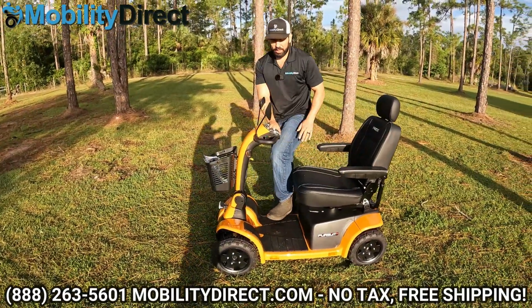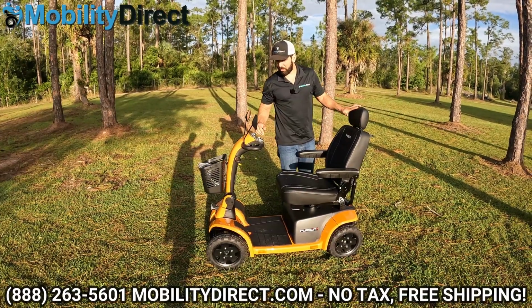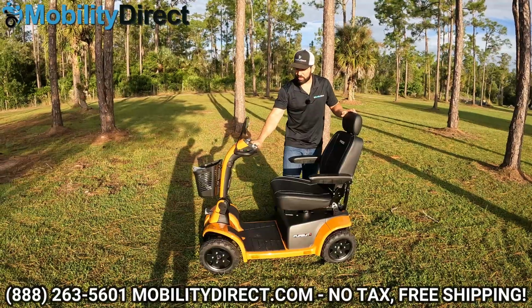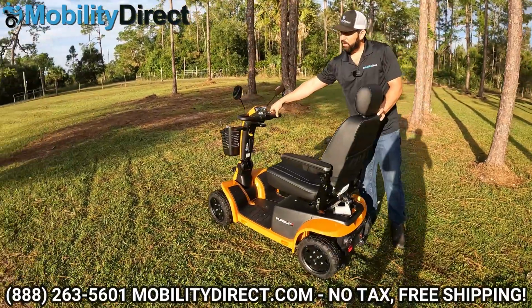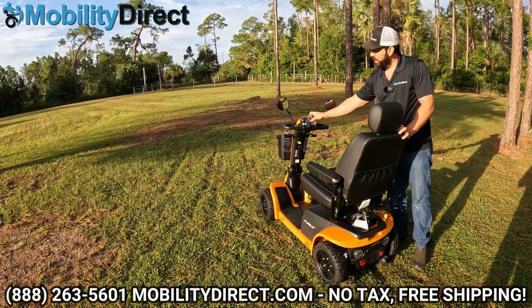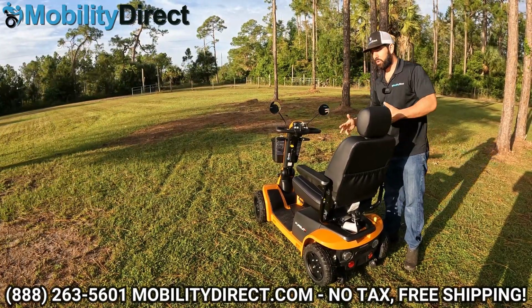Pride Mobility has incorporated a beep code system, so for example, it's actually a good time to show you one of those beep codes. If you turn the automatic braking system off, we talked about how it has automatic brakes. Right now the unit's on, and the only time the unit can move is if you use the throttle. Now let's say your battery dies. Can't push it because the brakes are locked. Automatic brakes, right? They're always locked.